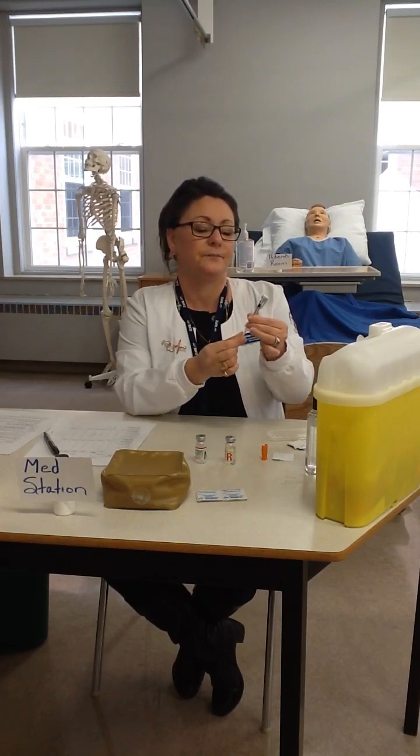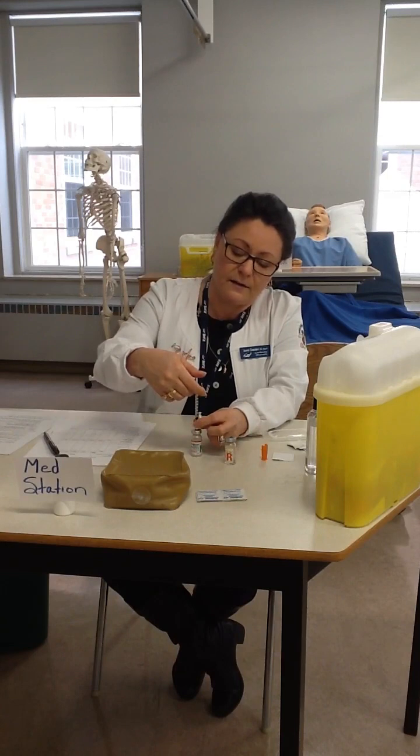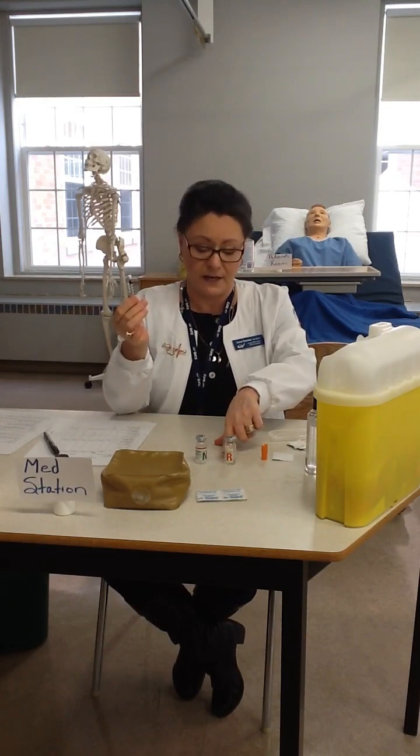And so I'm going to start by drawing up my air for my cloudy. And if I look at my MAR, it's 14 units of NPH. So I'm going to draw up 14 units of air. I'm going to stabilize my vial, pierce the top, and be careful with that needle because it's so fragile. And then I'm going to inject my air and pull that out nice and straight. And then I'm going to go over and add, I need 6 units of clear, the R, so I'm going to add 6 units of air. And I'm being careful not to touch the plunger, just the end here.